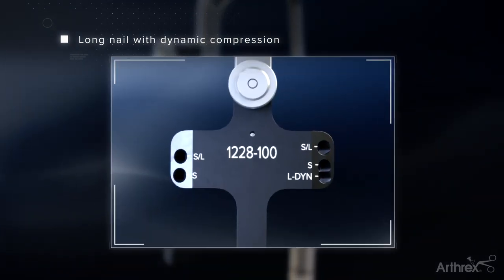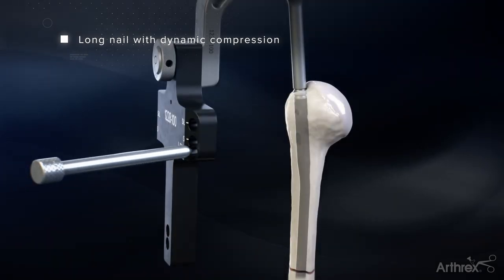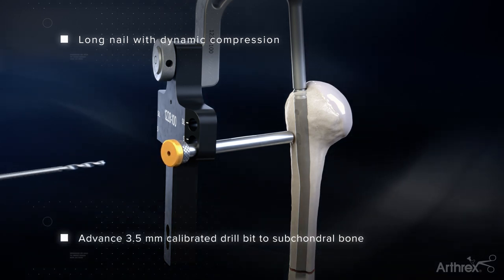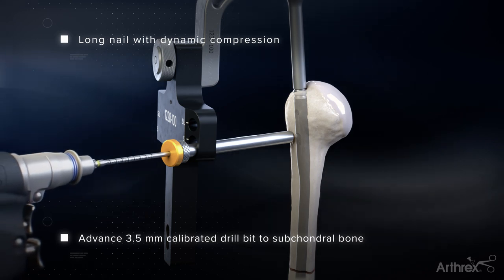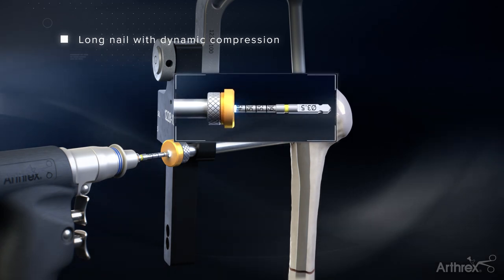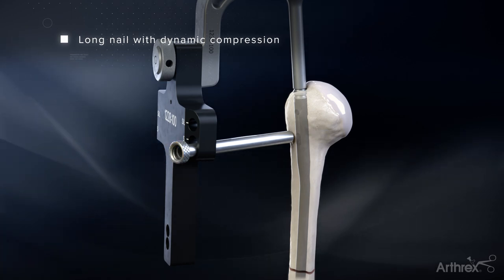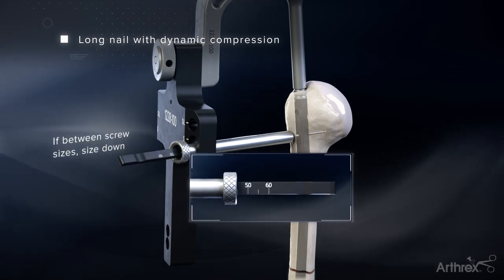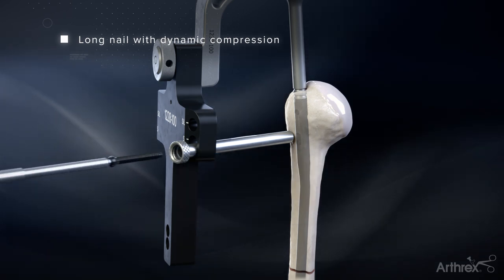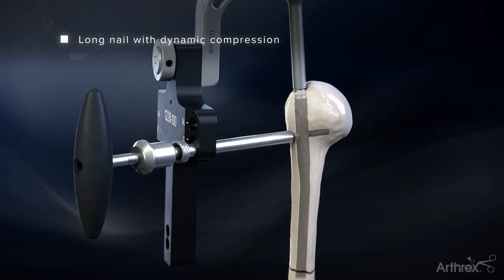After distal screw insertion, utilize the oblong hole on the targeting jig and insert the screw sheath and trocar through a stab incision down to the bone. Remove the trocar and thread in the gold 3.5mm drill sleeve. Advance the 3.5mm drill bit through the drill sleeve until just inside the subchondral bone, making sure not to drill into the joint space. Calibrations on the drill bit will indicate the depth of the screw needed. Measurement only corresponds to the threads of the screw and doesn't include the head of the screw. A hook tip depth gauge can also be used for measurement once the 3.5mm drill guide is removed. Insert the 5.0mm cancellous interlocking screw through the screw sheath using a 3.5mm hex driver and T-handle until the head of the screw is flushed to the bone.